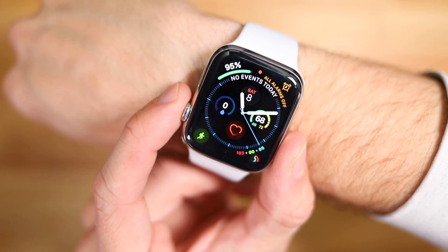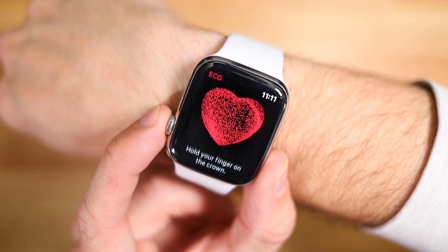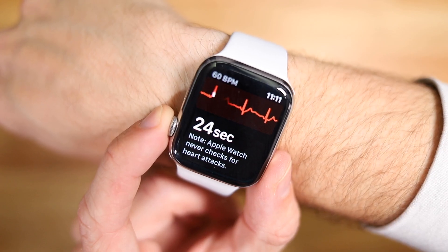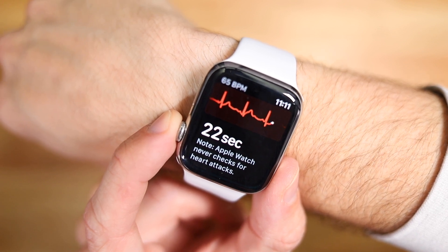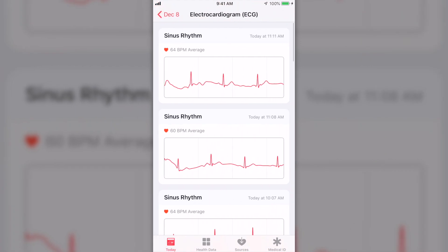The Apple Watch has always monitored your heart rate regularly, but to use the ECG functionality, it's actually really simple. There's a new ECG icon — you just open it up, place your finger on the crown of the watch for 30 seconds, and it monitors your heart and gives you the results, also sending them to your iPhone to store and analyze.